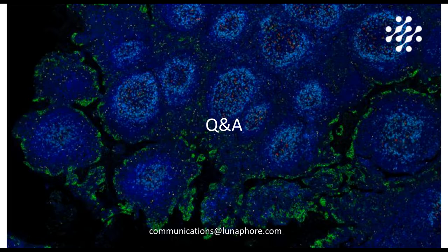Thank you so much. Now, how would you best use the LabSat, given that it's a single slide stainer? So LabSat Research is not a high throughput instrument. It's an instrument for low throughput needs, for precious samples, or for single-shot antibody optimization.